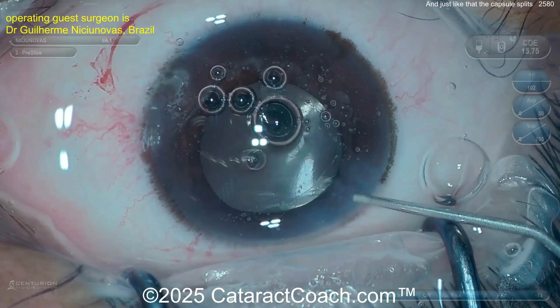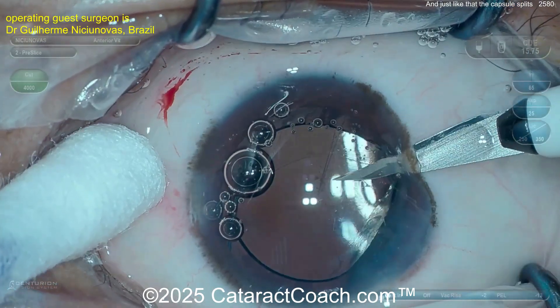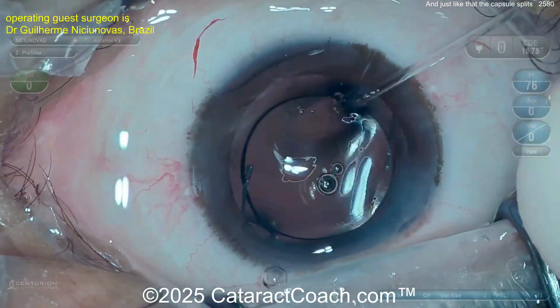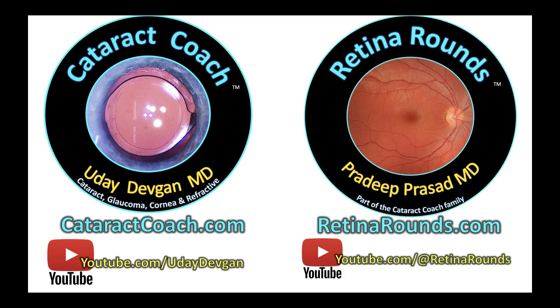Now you've got a barrier, and you won't get any vitreous prolapse. End of the case — check with triamcinolone, and it looks great. This will happen to you one day in your future; it's okay if it does. You can clean it up and finish the case nicely with no further issues — beautifully done.